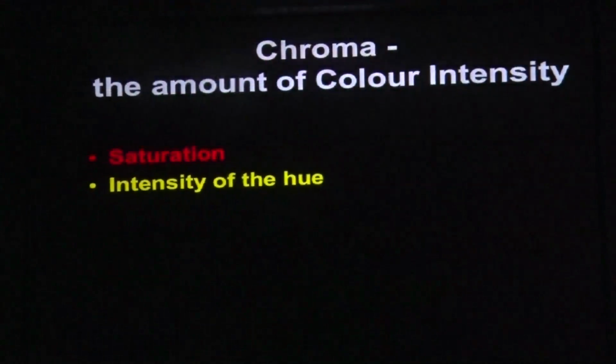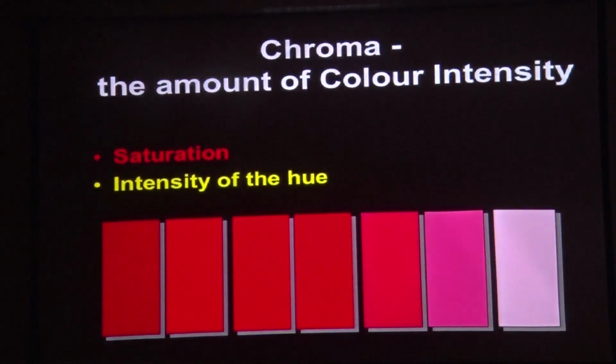Next point is chroma. As I said, no tooth is monochromatic. Every tooth is polychromatic, more so with canines. Any canine you look at of any patient is highly chromatic compared to the central and lateral. So now when I start looking from gingival to incisal, I start jotting down my chroma. Now if my shade is A, then in the cervical third it's always darker, so it will be A3 or A3.5. And then as I come down, I reduce the saturation of my chroma, so from A3, A3.5 it comes down to A2 and then it comes down to A1.